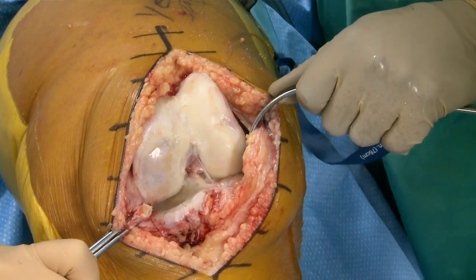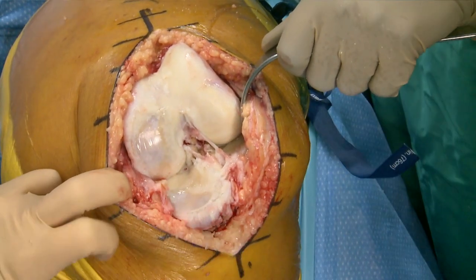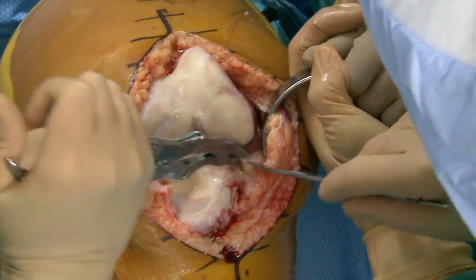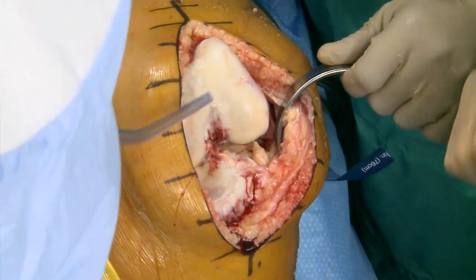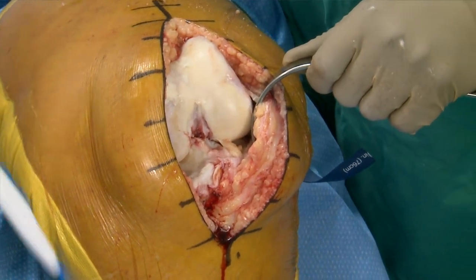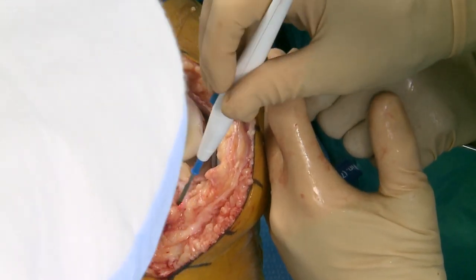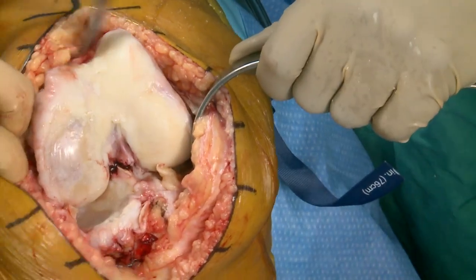We cut the ACL, and if we've done a decent exposure on the medial side we should be able to dislocate the tibia out, which I like to do right here. This allows us to get the lateral meniscus. I saved the medial meniscus for the end because I stress a lot about the medial collateral ligament. We've got a beautiful picture of anteromedial arthritis — that wear pattern on the tibia. We'll get that lateral geniculate for a better view.